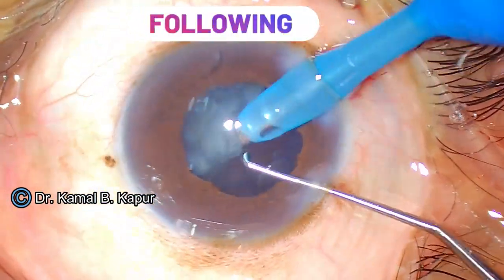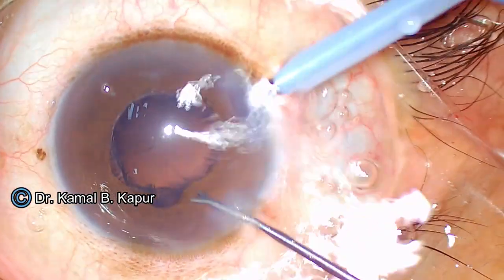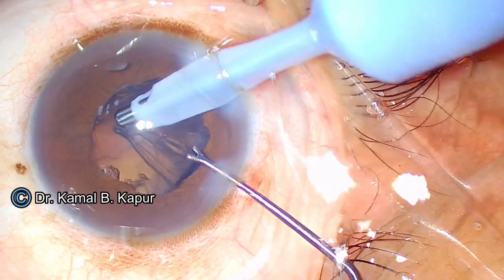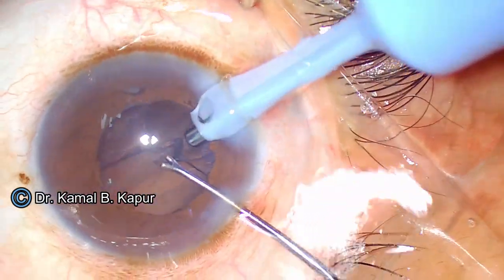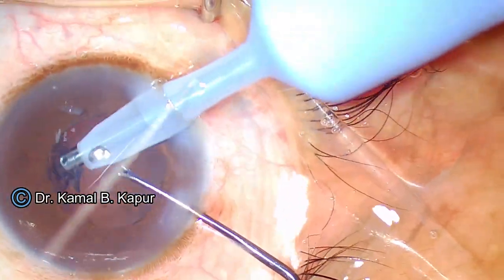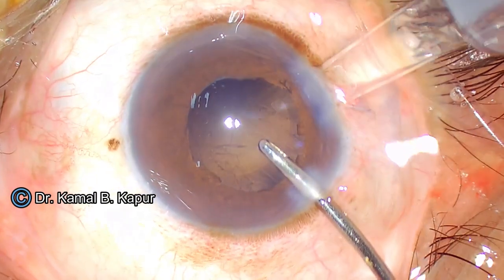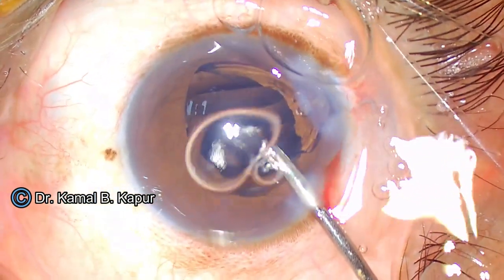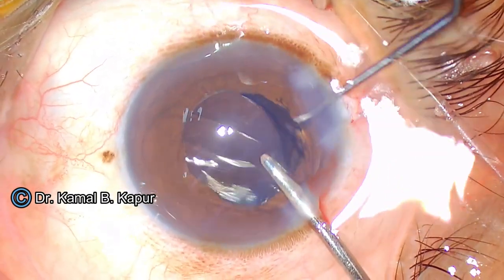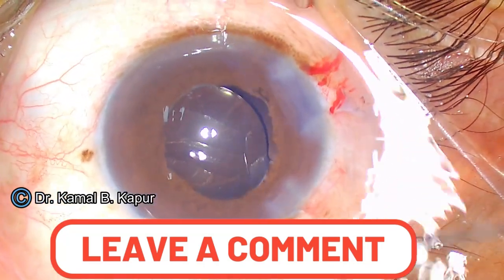We are fast-forwarding the video here to make the surgery video a little bit faster and less time consuming, because the area of interest for this video was to show a simple stretch pupilloplasty which can be used in these patients, where we can actually do a decent job of pupillary dilatation. We have a 5 mm pupil and the IOL is going in and the surgery is completed without use of any tools like pupil expanders, iris hooks, or any other tool like that.